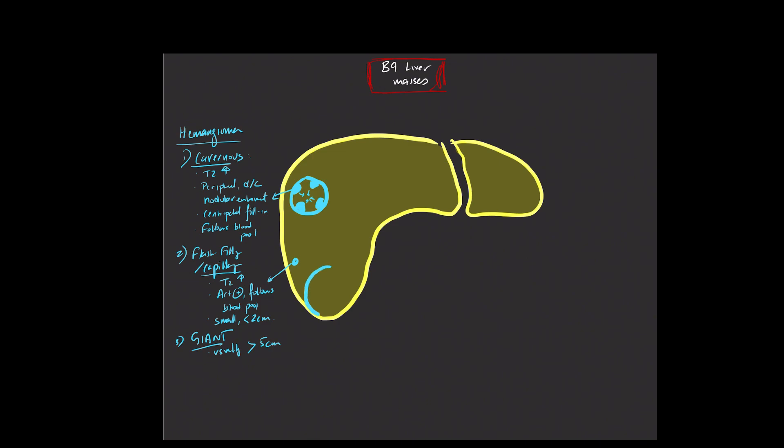Generally, the imaging features of a giant hemangioma will be very similar to the cavernous hemangioma, in that you're going to see a large mass with peripheral discontinuous nodular-like enhancement that fills in and follows the blood pool.